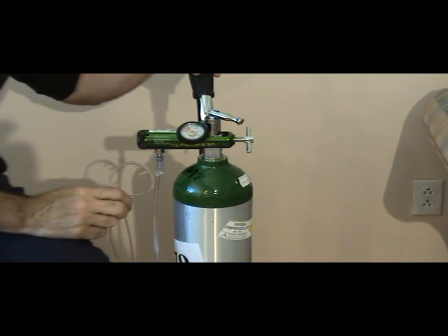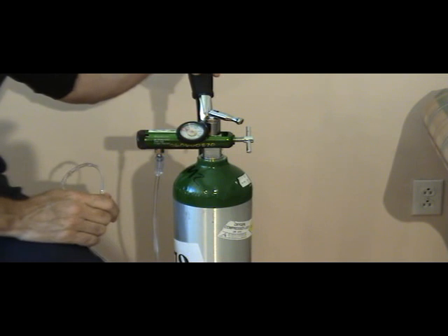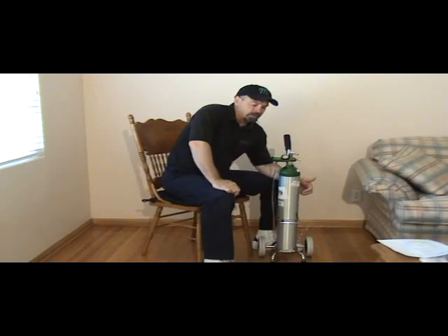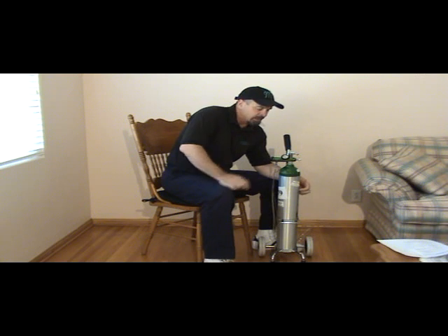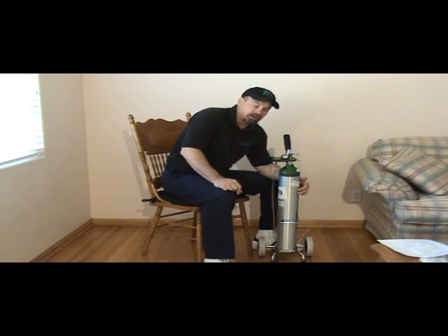Last part of the in-service I'll go over is some safety features as far as the tank goes, the backup tank. Number 1, you need to position this in a place where it's not going to get knocked over by children or dogs or anybody running through there. If a tank is knocked over like this and it hits against something hard and knocks the top off of this, it can become a missile, and you don't want that to happen in your house.